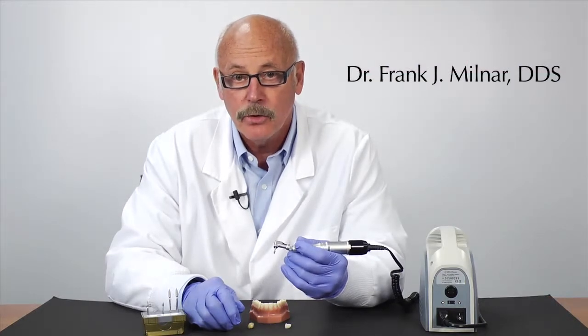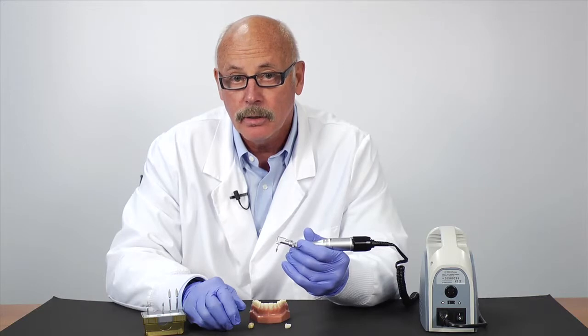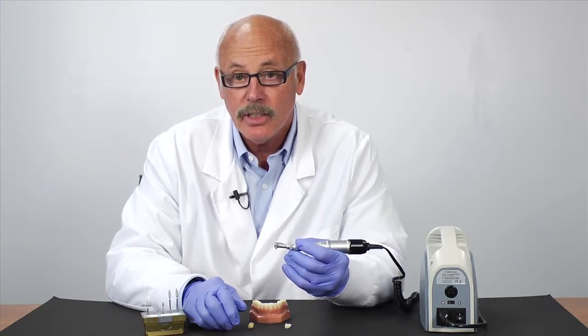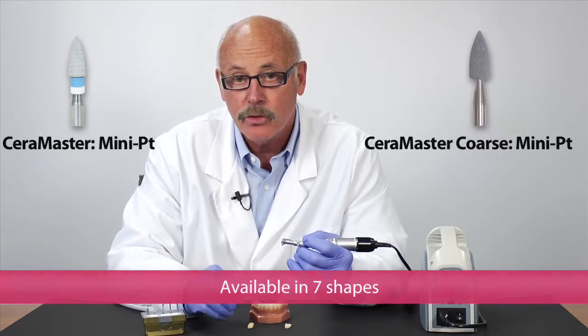The technique for adjusting natural tooth structure such as enamel and/or porcelain uses Sara Master and Sara Master Coarse — diamond-impregnated instruments. They are easy to use when adjusting two different mediums, accomplished in two steps.